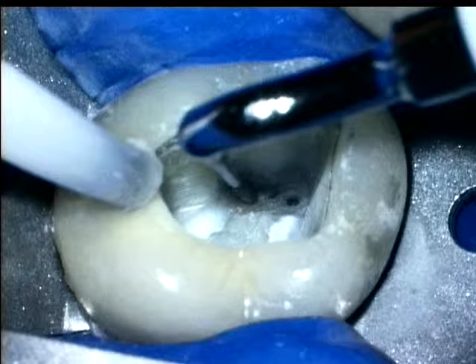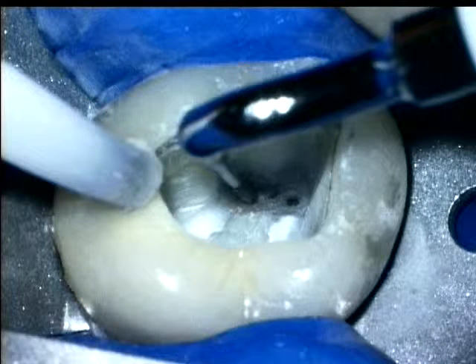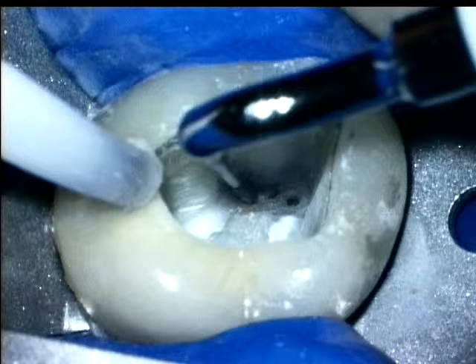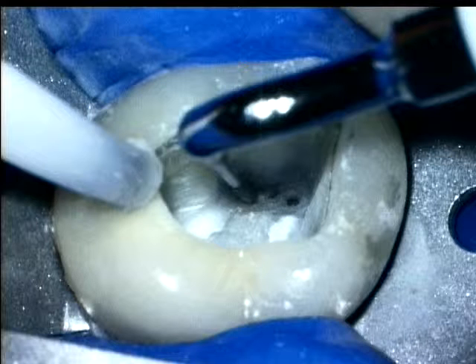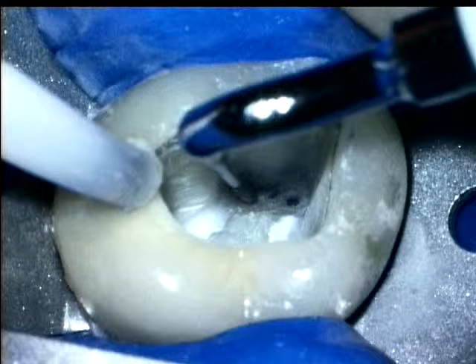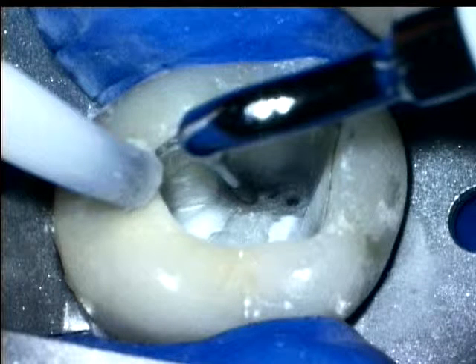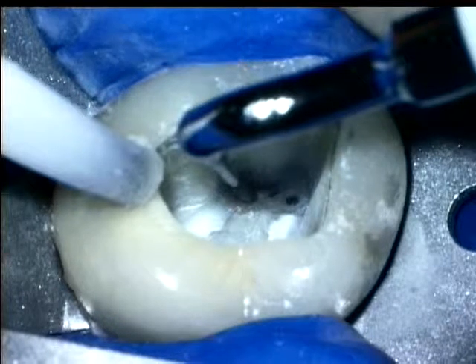This video shows how ultrasonics can be used for canal location. In the first example, an MB2 is being located in an upper molar.